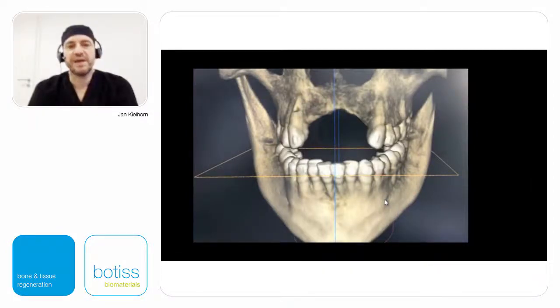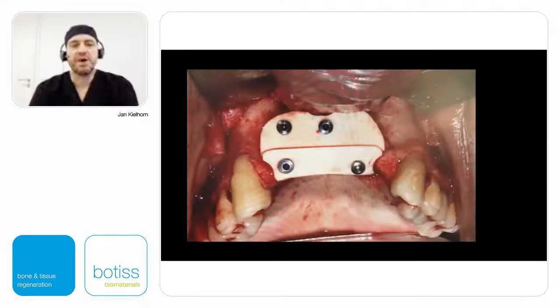Also, severe defects that we treated using hip augmentation can now be reconstructed using bone plates. You can reconstruct them using these plates and build a biological container which you can then fill with autogenous material or allograft particles and restore that easily, and place your implant after 4-6 months or longer, because a cortical strut from allograft material will be very, very stable and not be resorbed as the classical autogenous cortical plate.